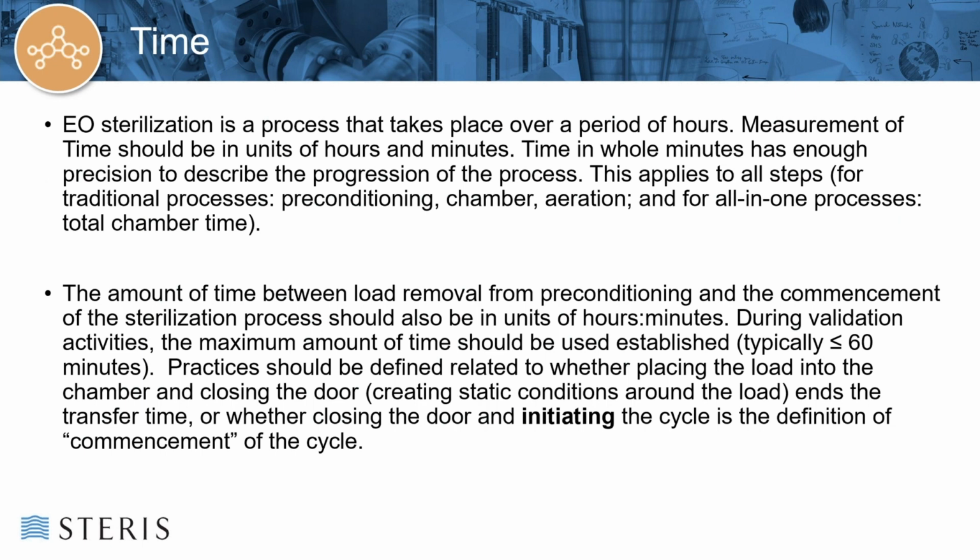You can look at the amount of time that would be required for spore log reduction to occur at the appropriate levels for the sterility assurance level that you want to achieve. And then you look at the sterility assurance level either through a calculated method or through your half cycle, both of which are overkill approaches for sterilization. But then you should confirm the minimum time during your MPQ in your validation, your microbial performance qualification.